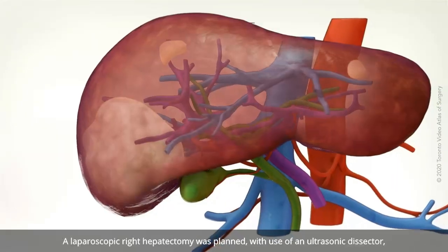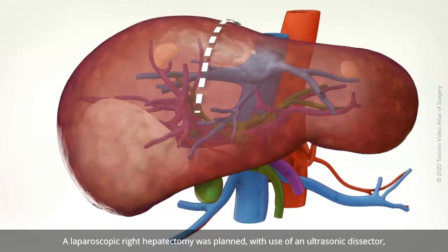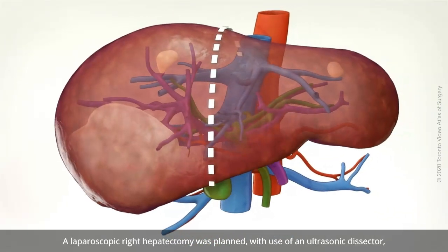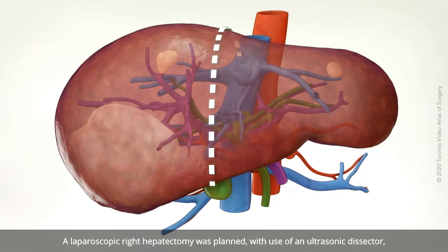A laparoscopic right hepatectomy was planned, with use of an ultrasonic dissector and intermittent Pringle maneuver during the transection phase.